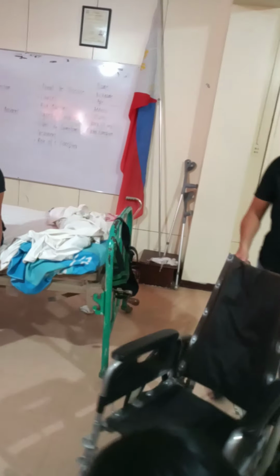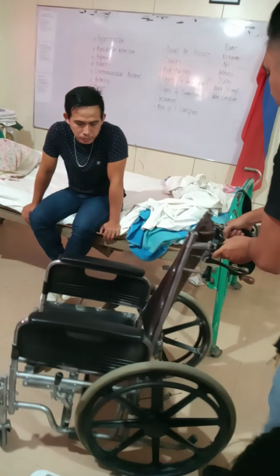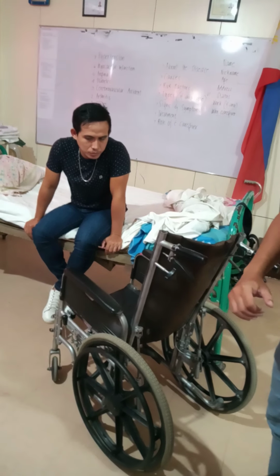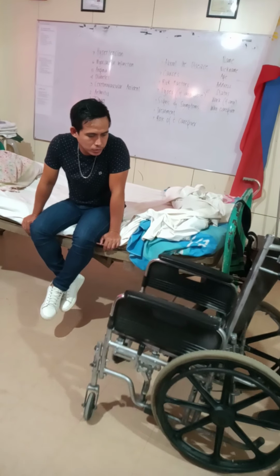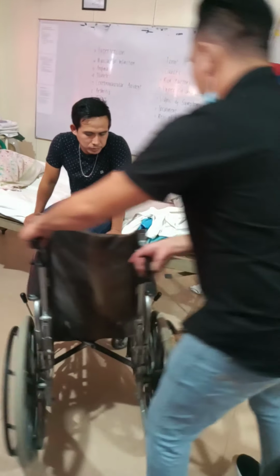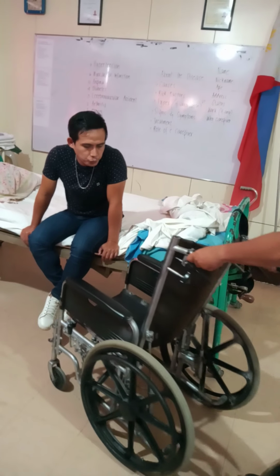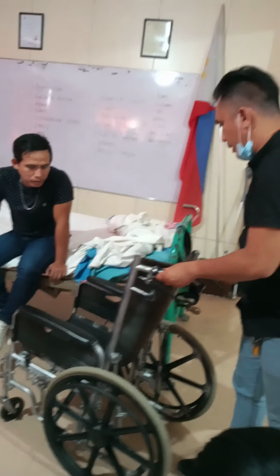Okay. Then dapat naka 45 degrees na siya angle sa bed. Ano? So that it will be closer for the patient to sit down sa wheelchair. Gets ninyo? Kung nakaingunan ni maguni siya, okay, tako pa siya glapon. Okay? If nakaingunana na siya, mutuyok pa si patient. But if naka 45 degrees na siya, okay, mas closer ni patient. Gets ninyo? Okay, masayon pa na siya. Okay?